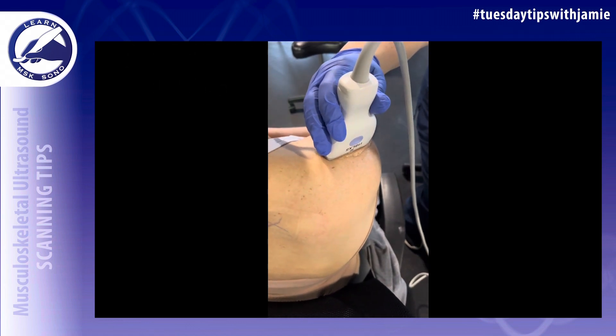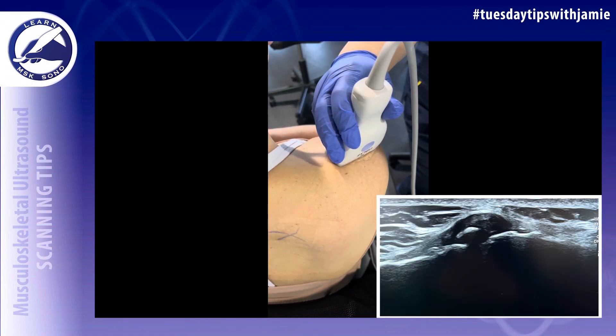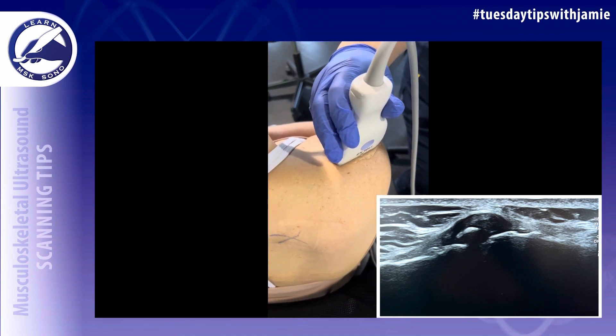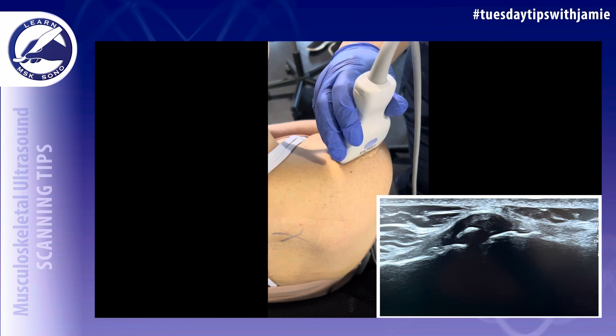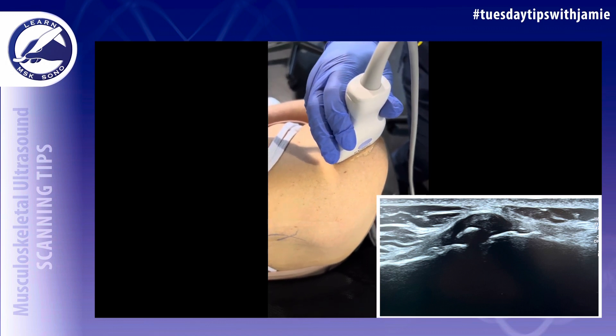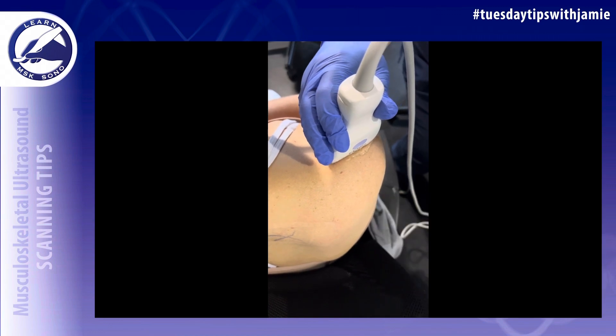Place the transducer on top of the shoulder, parallel to the clavicle and the acromion, to image the AC joint in the long axis. You need one image with grayscale and one with power Doppler.